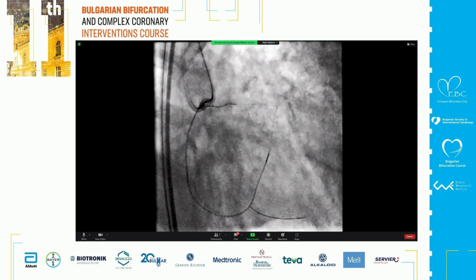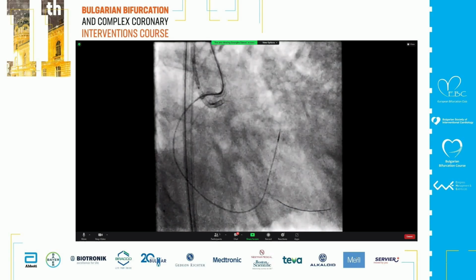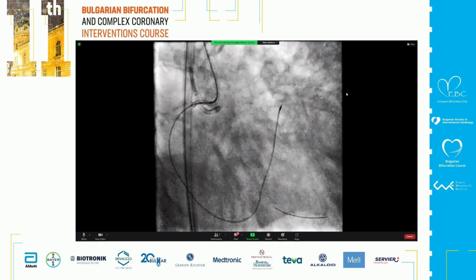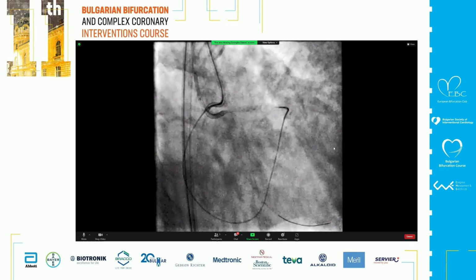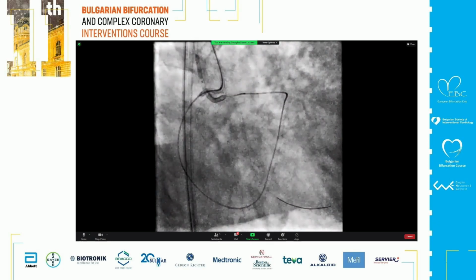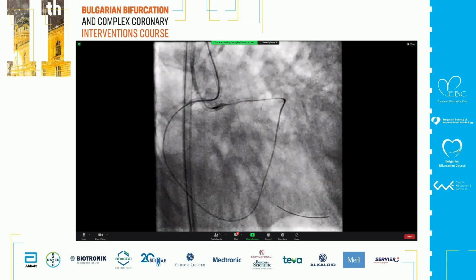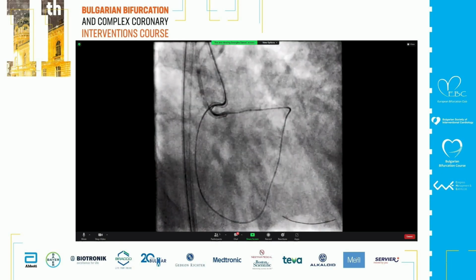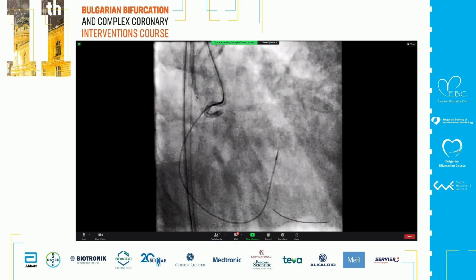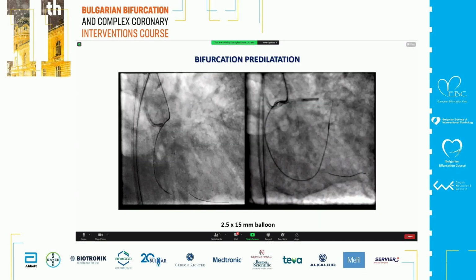So you see, you enter the guiding catheter extension. Then what you do here with the guiding catheter is trap your retrograde wire, and you have the power to advance your retrograde microcatheter. You will see quite a lot of calcification in this LAD. You see that these microcatheters are excellent, and tomorrow, because I have the talk about CTOs and calcium, I will present only 2 cases of the last 3 days, just to show you the evolution of things. And then the microcatheter is crossing.